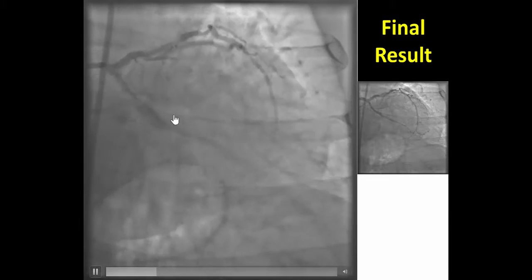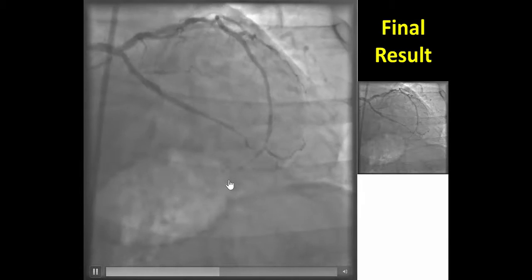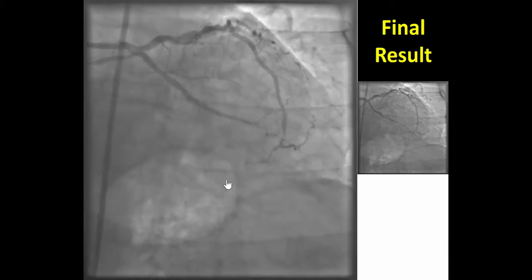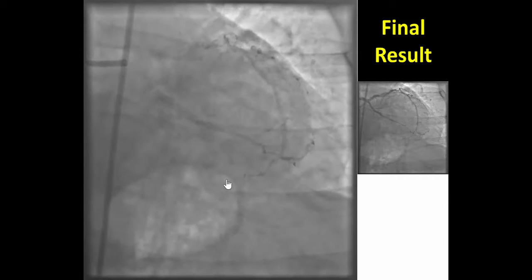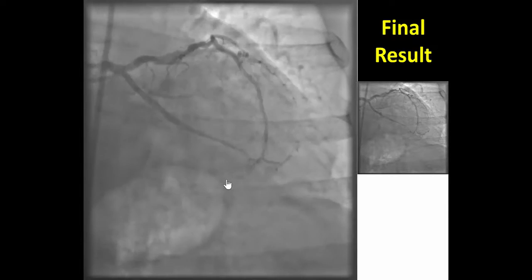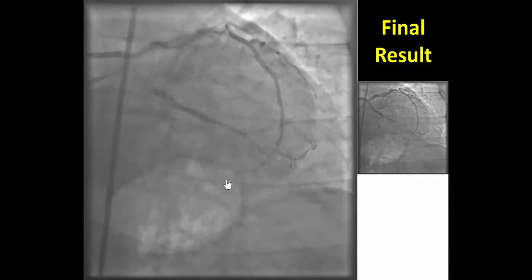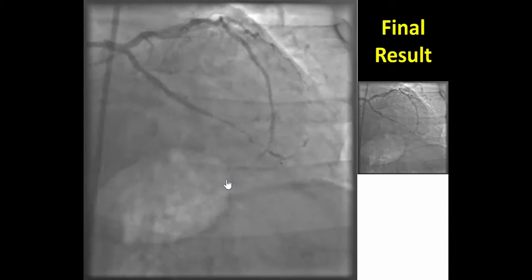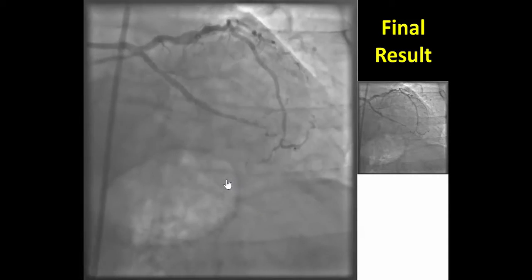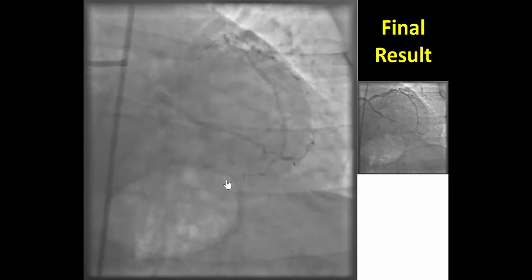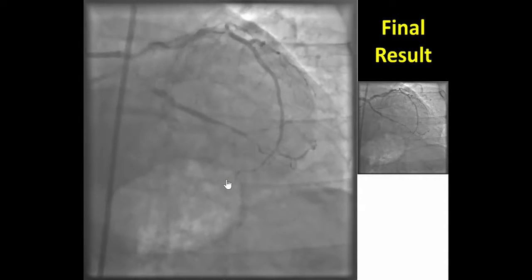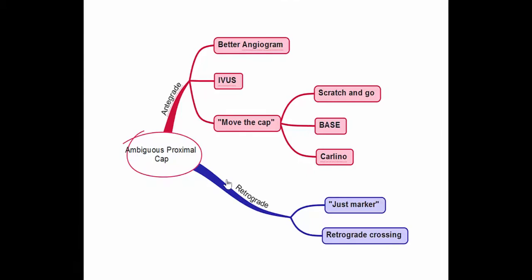Following stenting, there was restoration of flow into the circumflex. Unfortunately, we lost the distal branch of the obtuse marginal. In cases like this, it is sometimes better to not try to re-canalize it given the small size and high complexity. This also illustrates the challenges when there's a bifurcation on the distal cap, because if the lesion is crossed sub-intimally, there is a high likelihood of losing that side branch.